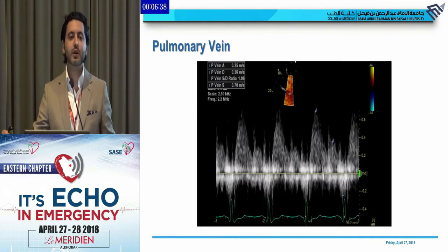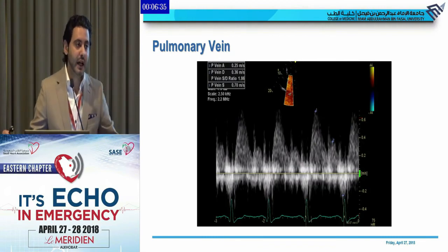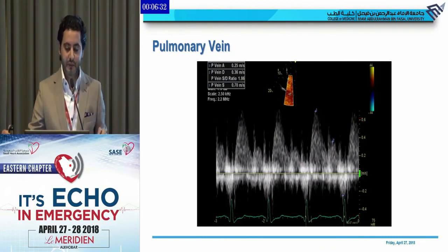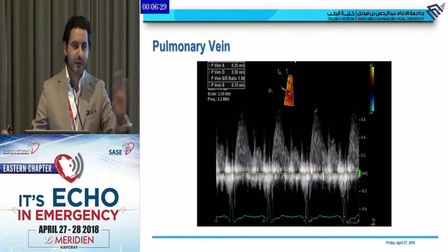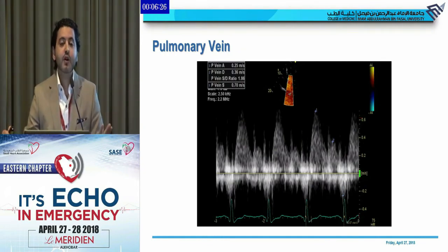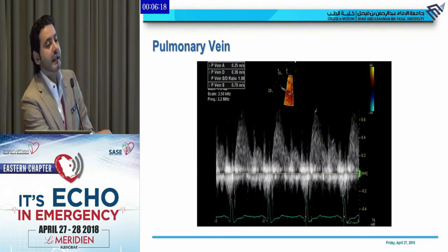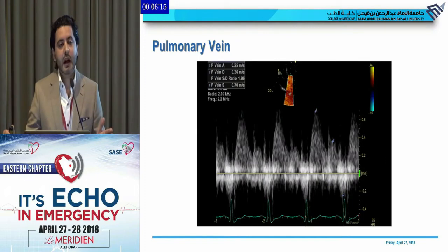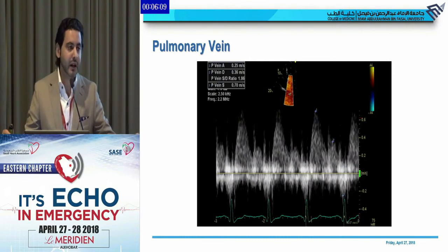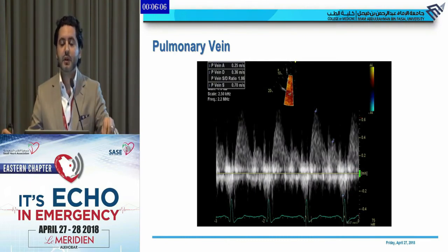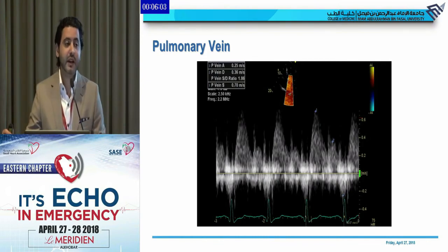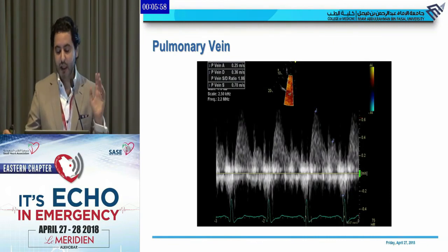If there is one thing to remember outside the algorithm: remember the pulmonary veins. Before you say indeterminate, have a quick look at a pulmonary vein. Normal pulmonary veins have a systolic wave bigger than the diastolic wave. If the diastolic wave is bigger, this is abnormal — unless the patient is young, under 40, with supernormal diastolic function, in which case the E prime relaxation velocity will be very high.